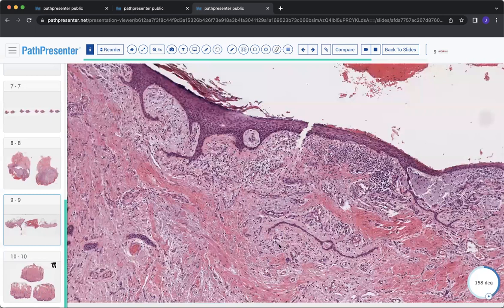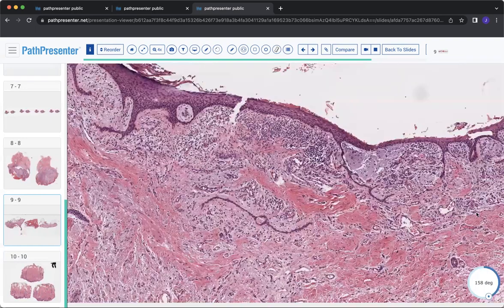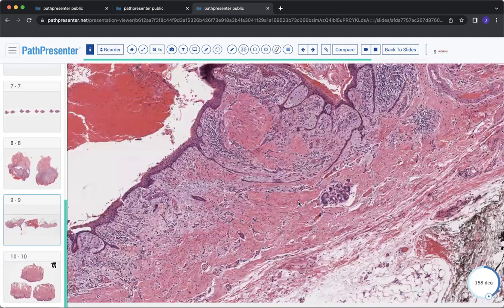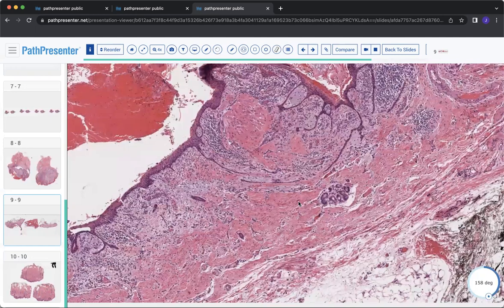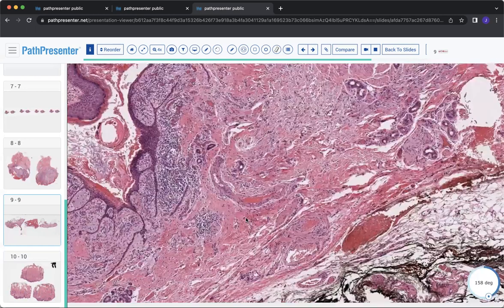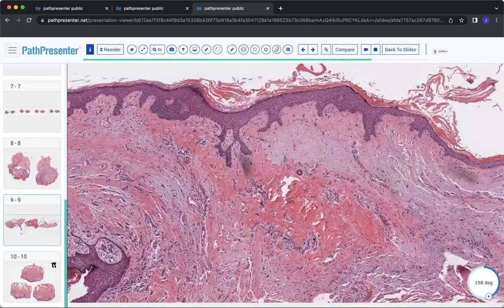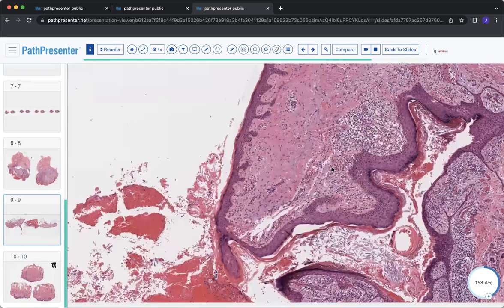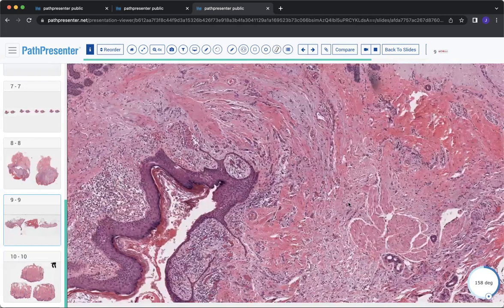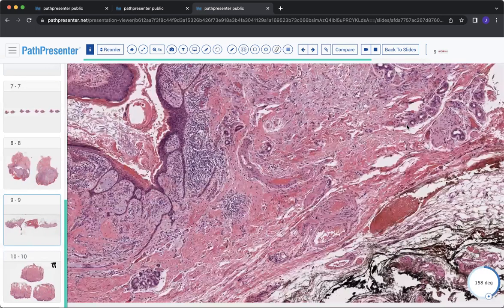And the reason that I'm showing you this and pointing out different features is because if it were cut in a different section, and according to Dr. Elston's textbook, you might see an entity that looks like what we call fibrofolliculoma. So fibrofolliculomas and trichodiscomas, there's a little bit of debate to say that they're probably very close to the same thing, if not the same thing. It is made up of a population of cells that seem to be recapitulating parts of the hair follicle.